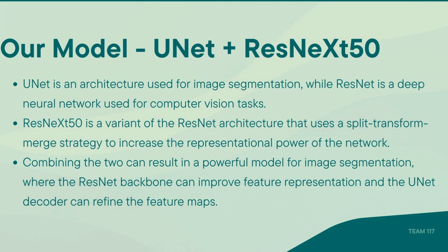For our model, we modified the UNet architecture by changing the encoding layer to a ResNeXt 50 backbone, and the corresponding decoding layer was designed. ResNeXt 50 is a variant of the ResNet architecture that uses a split-transform-merge strategy to increase the representational power of the network.